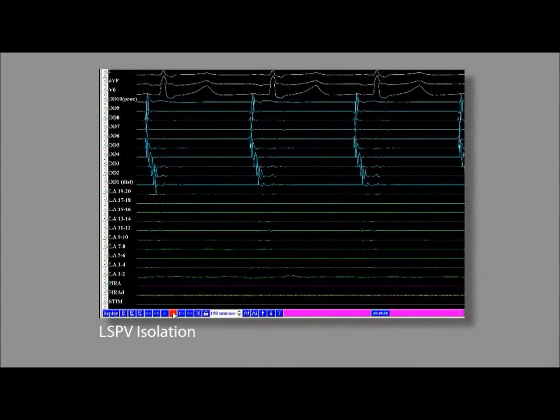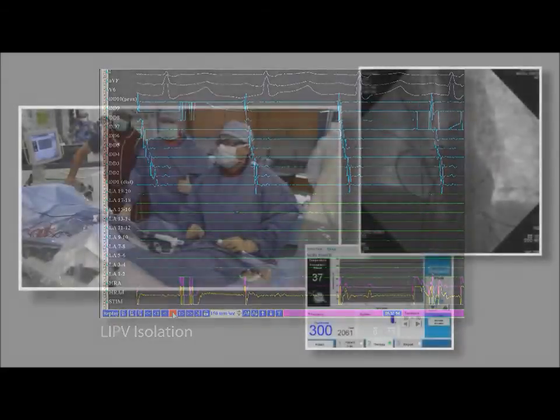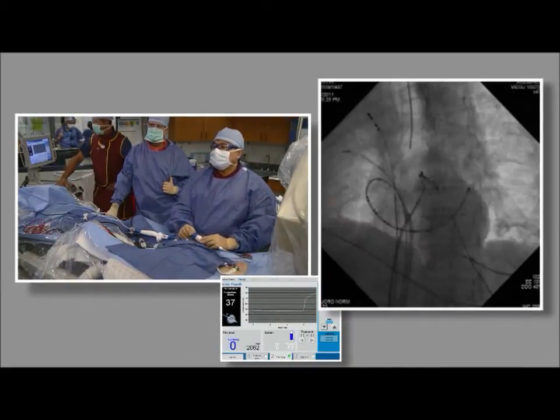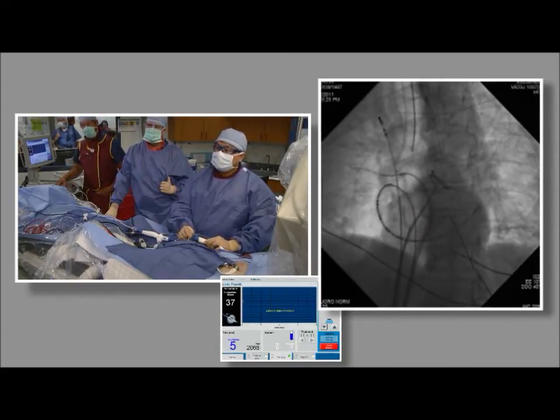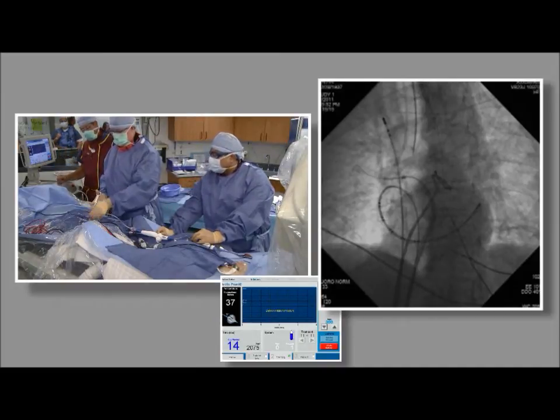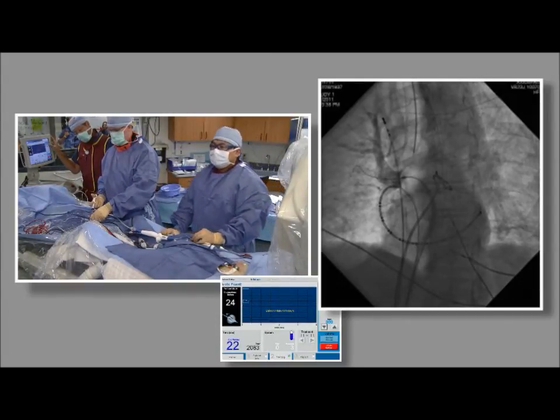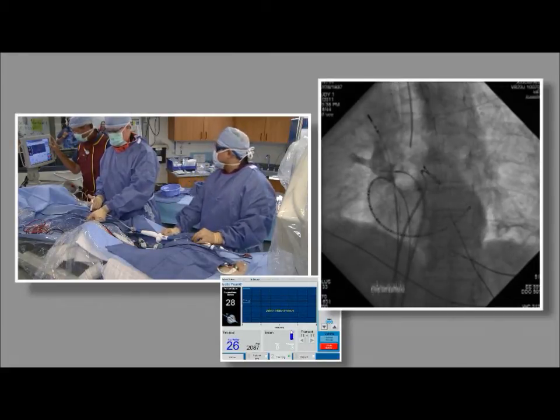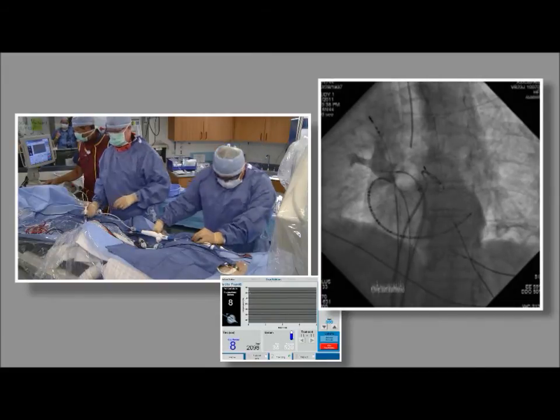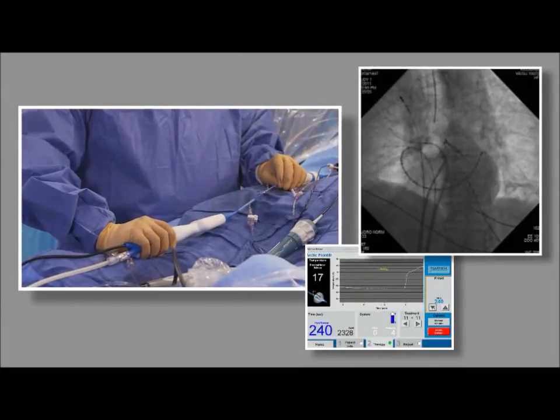Left-sided veins are very well isolated. Going back to the right superior vein with the balloon up. Shooting the venogram — a much better coaxial location, which is a good choice given the branch we saw. Making sure the balloon didn't move — we still see contrast there, confirming occlusion. Dr. Hsu completes the second freeze of the right superior pulmonary vein.